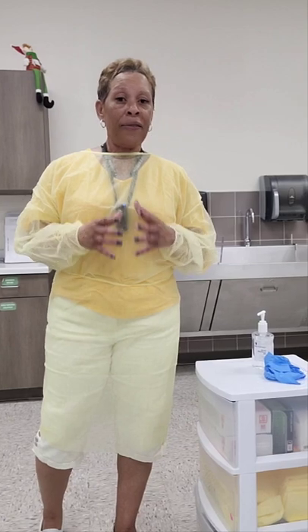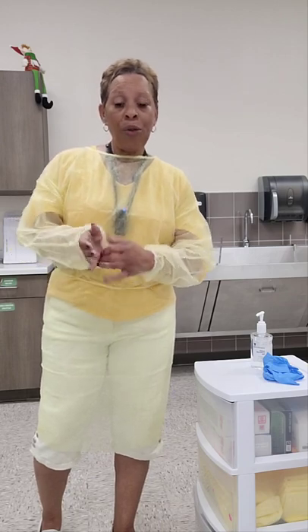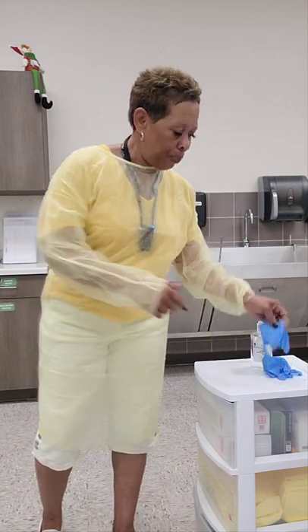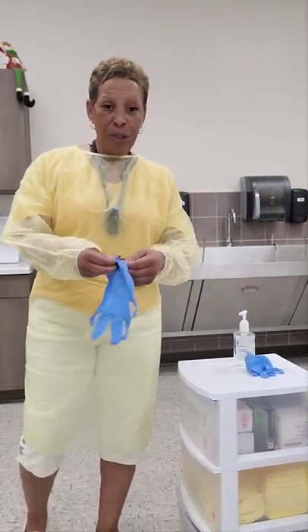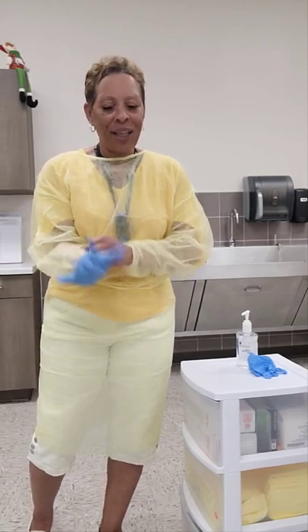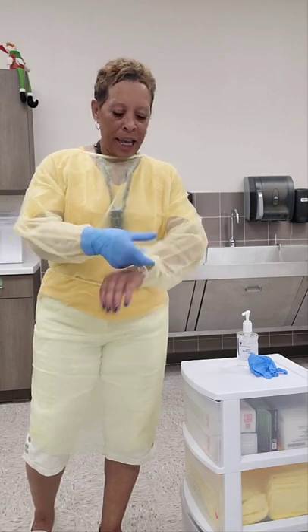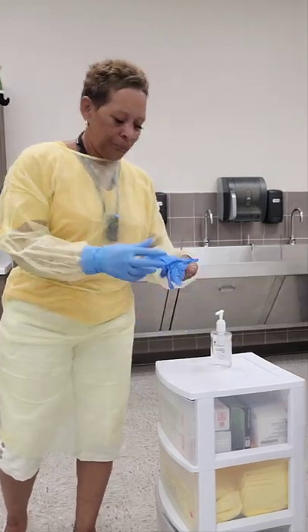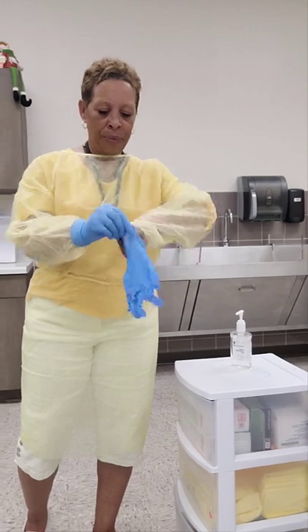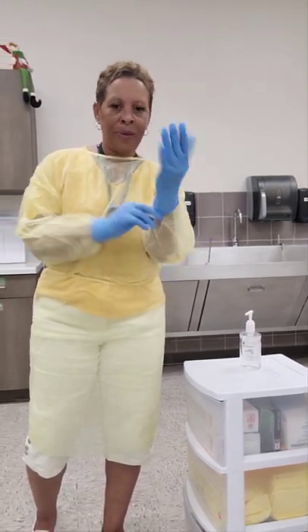The cuff of your gloves has to cover the cuff of your gown. The easiest way to ensure this is to pull the cuff of your gown midway down your palm and then place your glove. This way you won't be fighting to get the cuff of the glove over the cuff of the gown. I'm going to do the same with the opposite sleeve. There we go.